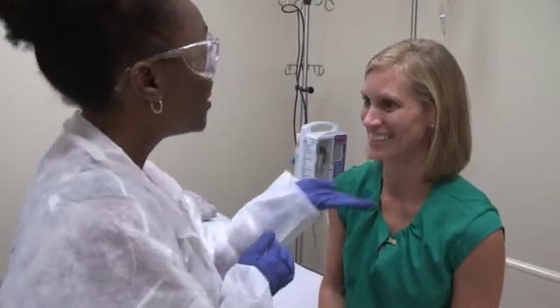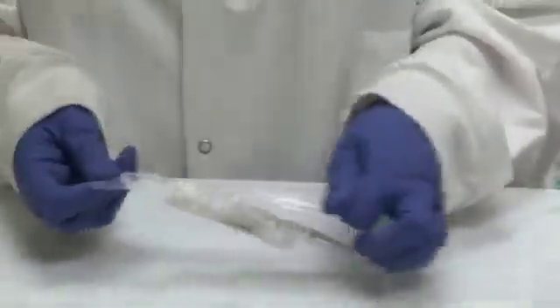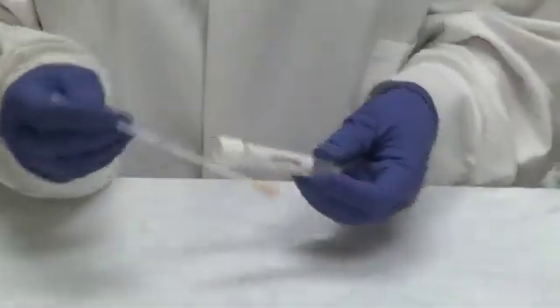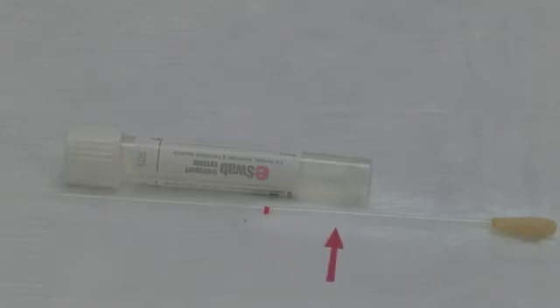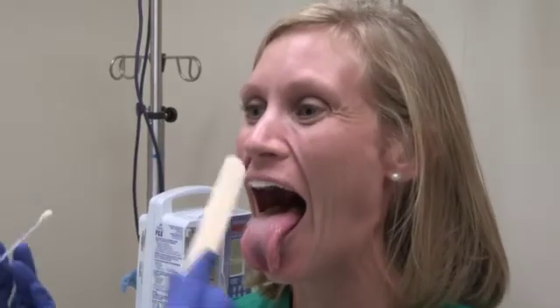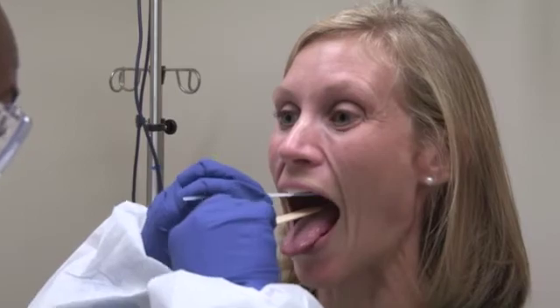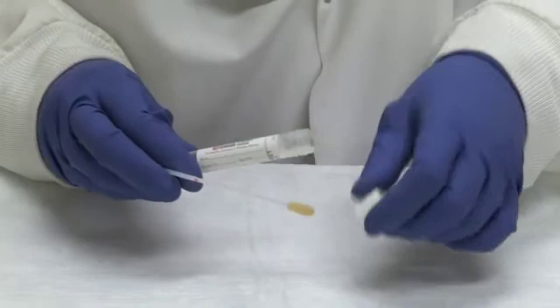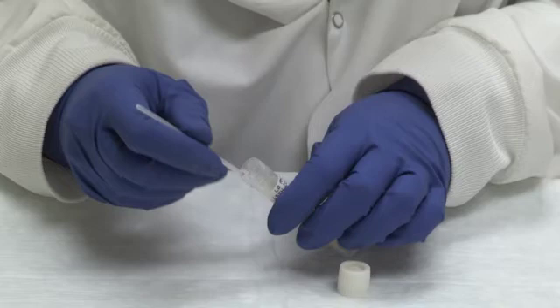Always remember to perform hand hygiene before and after the procedure. Explain to the patient what you are about to do. Open the swab package and remove the swab. Avoid touching the swab applicator below the molded breakpoint as this could lead to contamination and incorrect results. Firmly sample the back of the throat and tonsil area by pressing and rotating the swab during collection. Gently remove the swab from the patient. Remove the screw cap from the tube and insert the swab into the transport container all the way to the bottom of the tube.